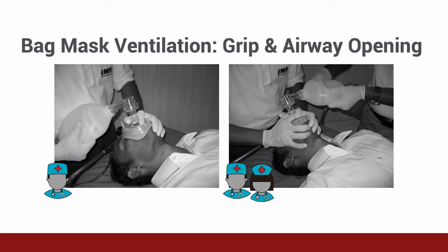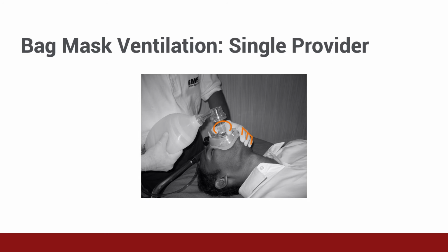At this point, the technique differs slightly depending on the number of providers available to perform the procedure, one provider or two. Let's go through the single provider technique first. Sounds good. In a setting where a single provider is performing bag mask ventilation, after placing the mask on the patient's face, the provider must grip the mask to create a gapless seal between the mask and the patient's face while also opening the airway.